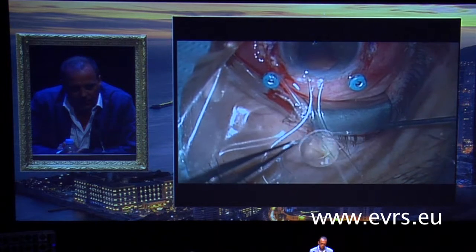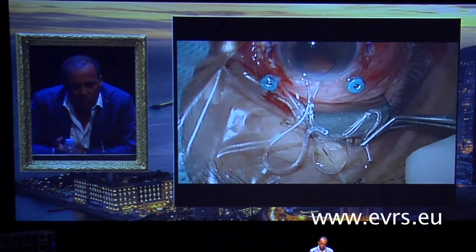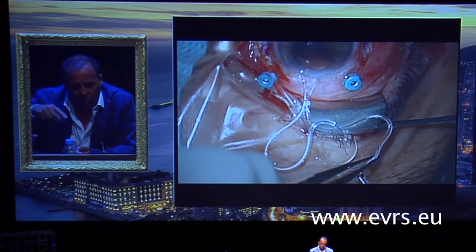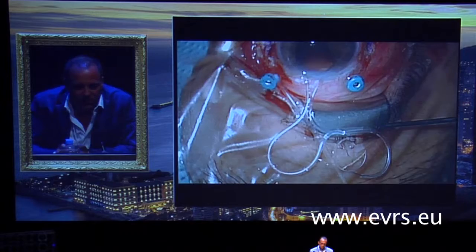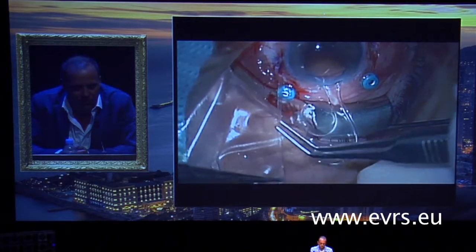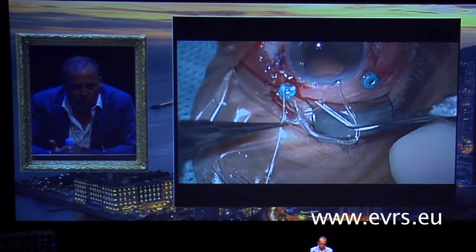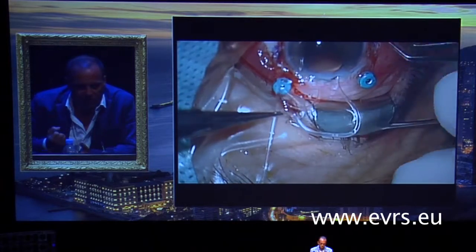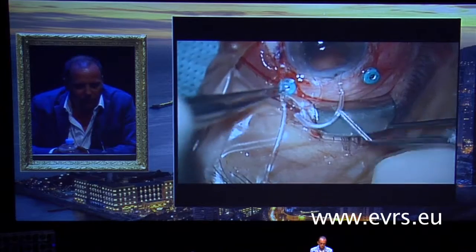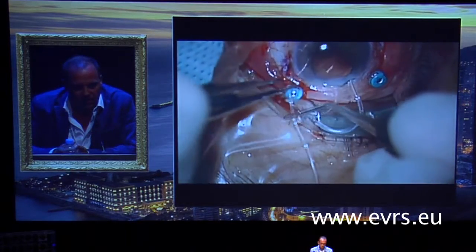One and the other one. And then you just have to pull the tube, and the haptics just follow the tube and go inside the sclera without traction, without bending, without using any forceps. You just pull it. You never lose the haptics because the suction of the haptics maintains the IOL stable. So from one side and the other, the two haptics go inside the sclera.